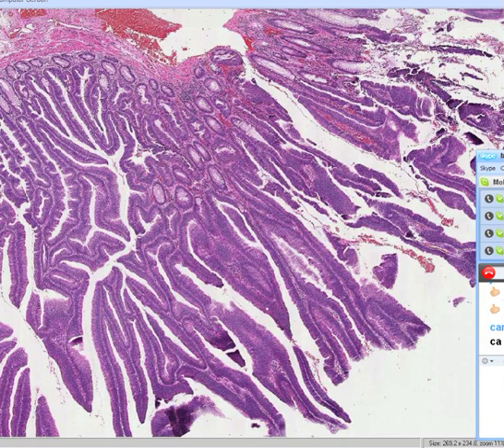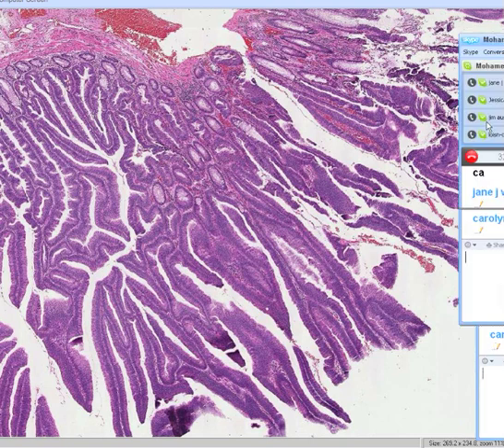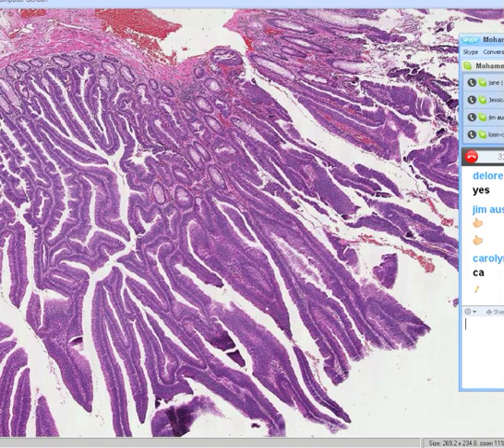That is not a bad guess, because villous adenomas have an extremely high correlation with adenocarcinoma. So if you wanted to call it cancer, that wouldn't be terribly wrong, because this is a villous adenoma. And I told you that whenever you see a villous adenoma, it has an extremely high correlation with the development of cancer, whereas the tubular adenomas, or what we call the adenomatous polyps, have a statistical association, but it's not very high. And the fact is most of them do not develop into adenocarcinomas.